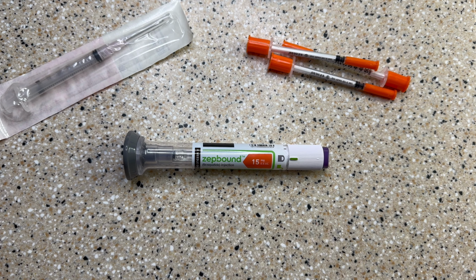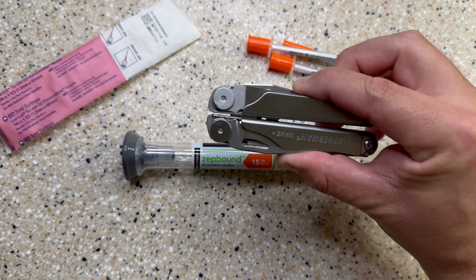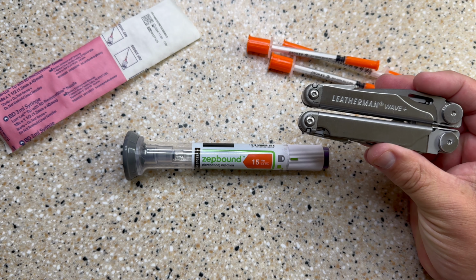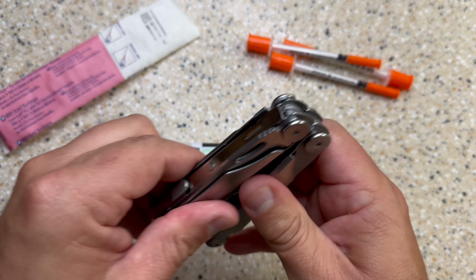What you're going to need here is a new sterile syringe. First, you're going to need either something like pliers or channel locks. Right now I have a Leatherman with me, so this is what I'm going to use. So let's get started.